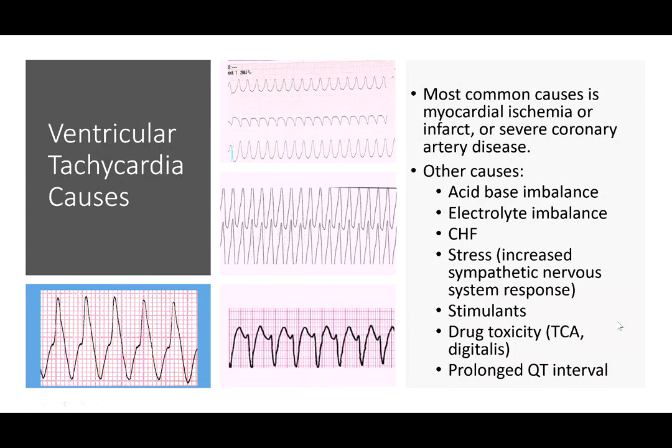This could cause an R-on-T phenomenon, could potentially throw you into VTach or VFib, so something we definitely want to watch out for. Usually, if they're following their medications regularly, we're not going to see this. It's when we have overdoses on our TCAs that we see this.